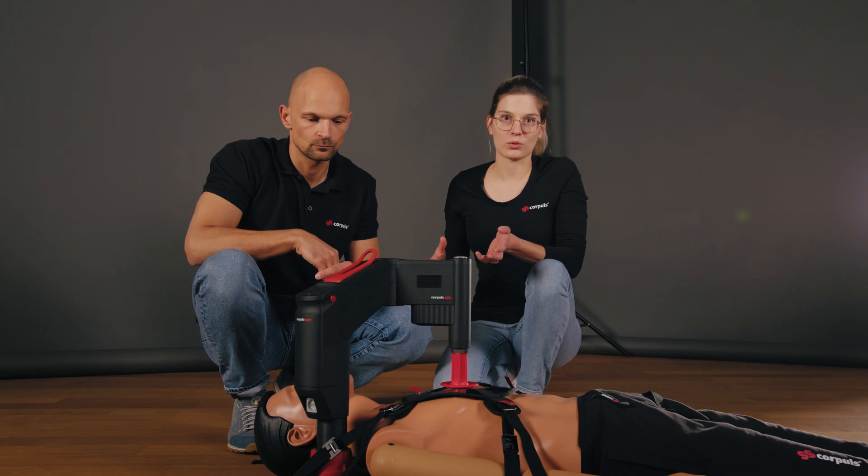In summary, this video covered the different alarm priorities and how the stamp position control works, the most common alarms and how to fix them, and what to do when a red alarm occurs that cannot be immediately identified — which is stopping mechanical CPR and transitioning to manual CPR.